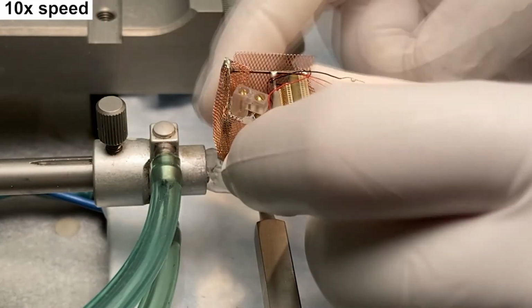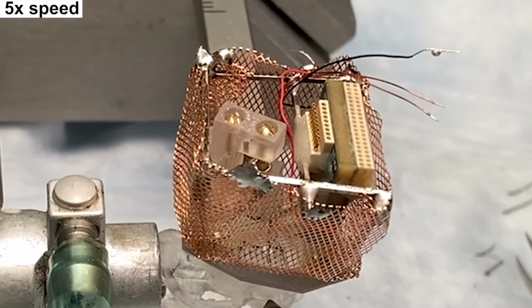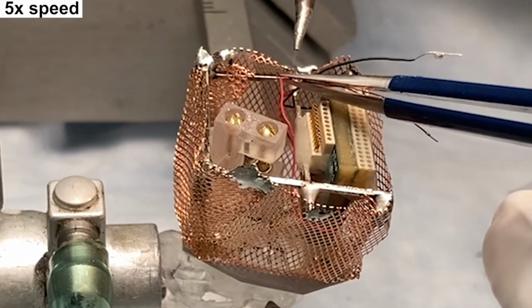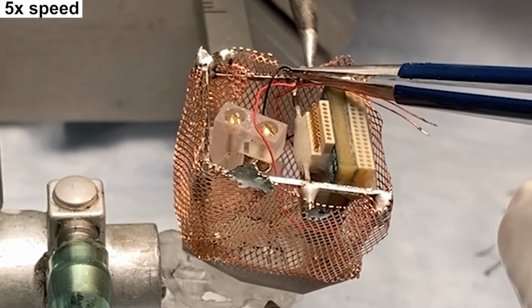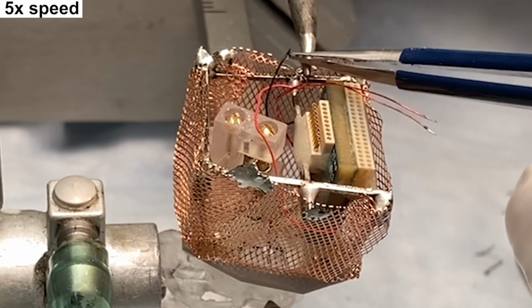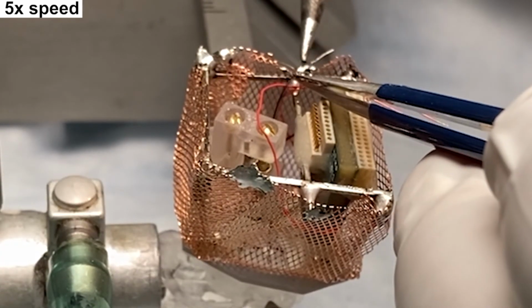And once this is completed, the one step remaining is that the ground and reference screws should be soldered to the copper mesh. And you can just pick a spot. Just be careful when you solder your wires that you are not in the way of your screw, or that you don't bump into the silicone shanks with any of these wires.